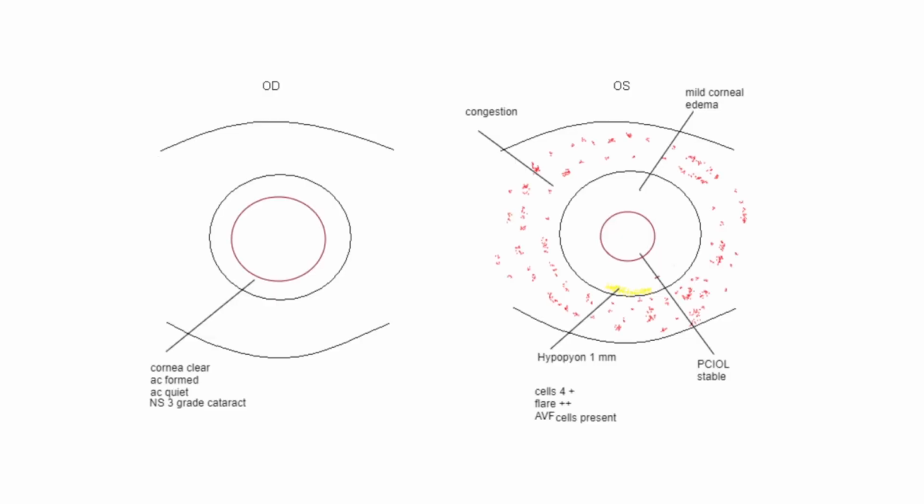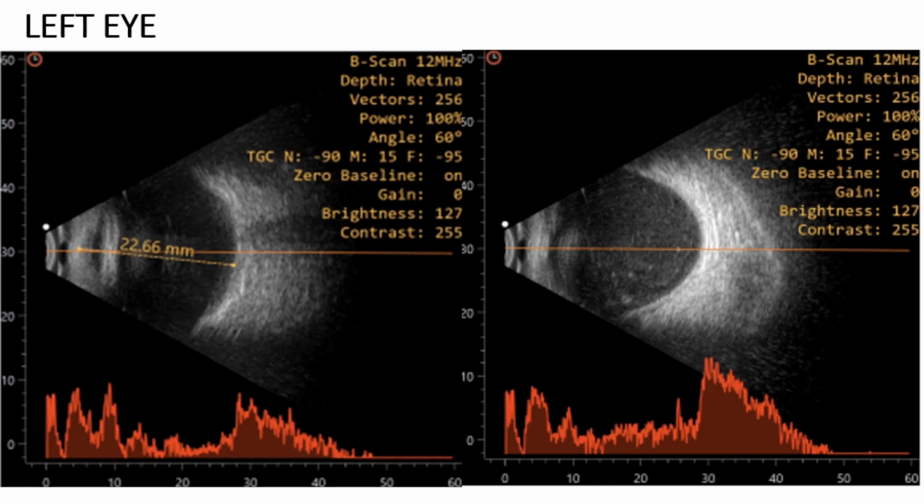Anyway, this patient came to you after the YAG capsulotomy, so somebody had seen the fundus before the YAG capsulotomy. Yes, before the YAG capsulotomy the fundus was seen at that time. It was normal. Okay. You go ahead, because in the ultrasound class we'll go on to the ultrasound. Who's describing? Aditi, sir.